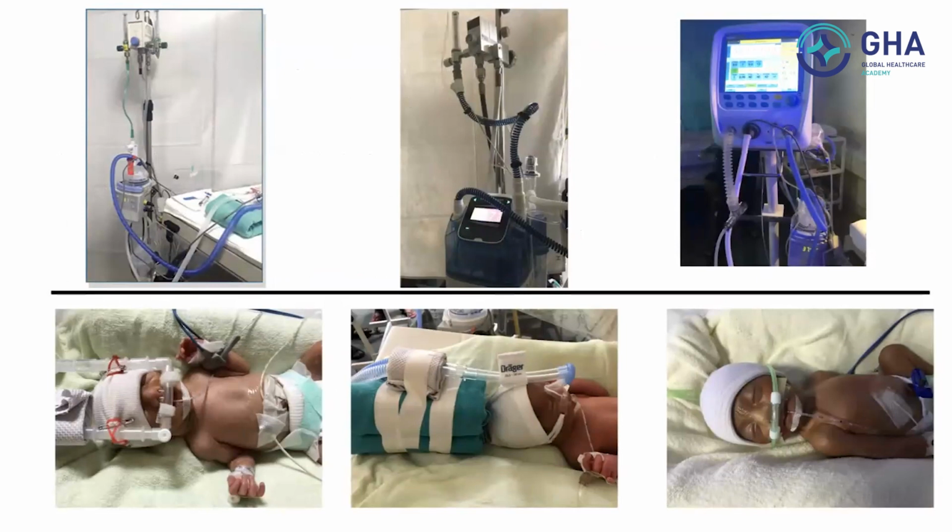Now when do you use what? Most of the time we prefer to use a bubble CPAP. But if you are in a tertiary care setup, it is better to use bubble CPAP, and use the ventilator for babies who have respiratory failure and do not have good breathing efforts. But for babies who have breathing efforts and have difficulty in breathing, CPAP is the best therapy. And as I said, CPAP is more cost effective and easy to do. The nurses can do it; the nurses need to learn how to give CPAP for all babies. So this baby would have been started on CPAP in our unit and most units, and you could have used a bubble CPAP or another machine like this.